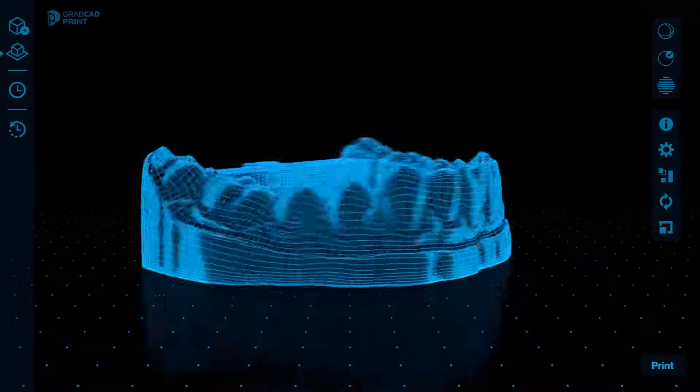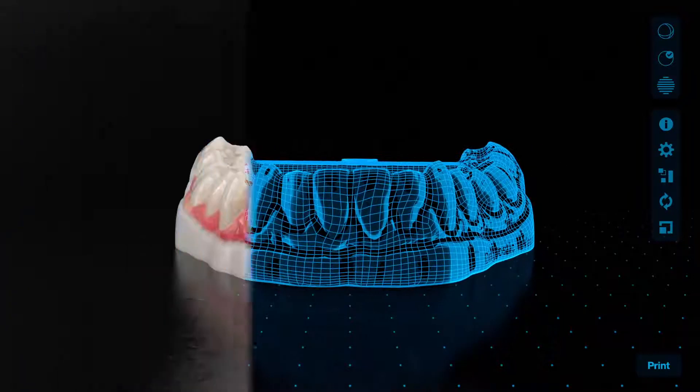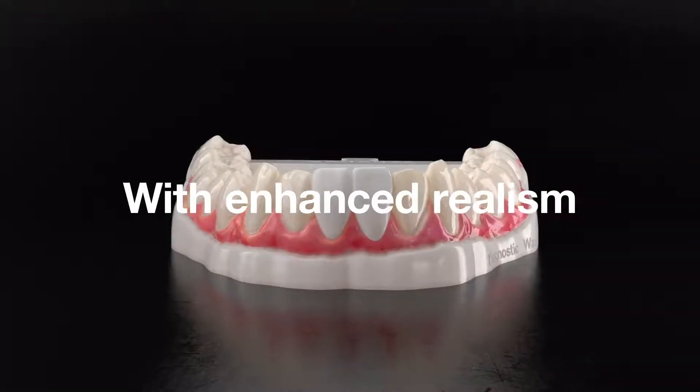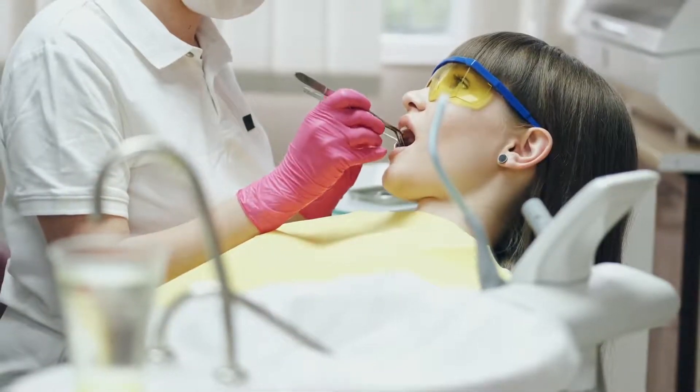Deliver patient-specific, full-color case presentations, with realism previously only possible with time-consuming wax models, and better your communication with clinics.